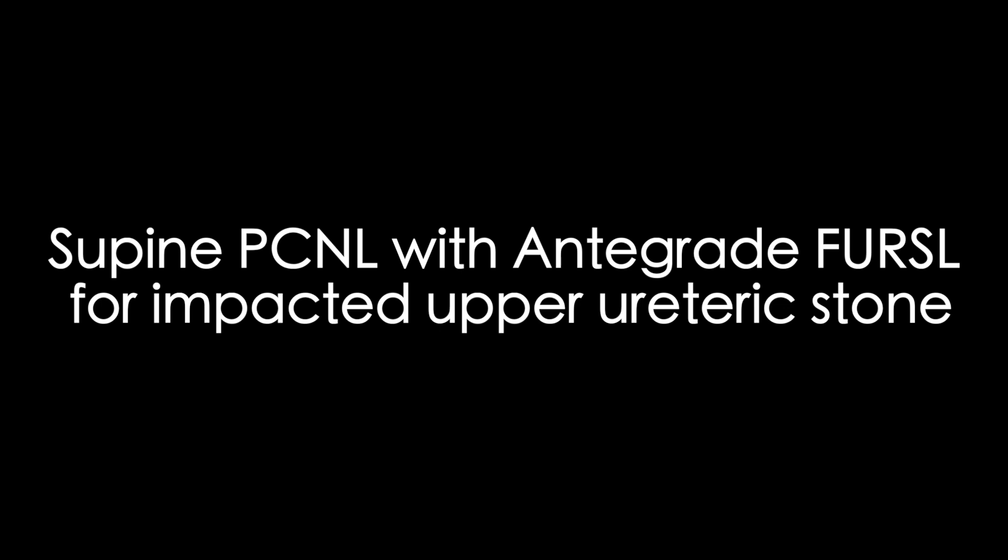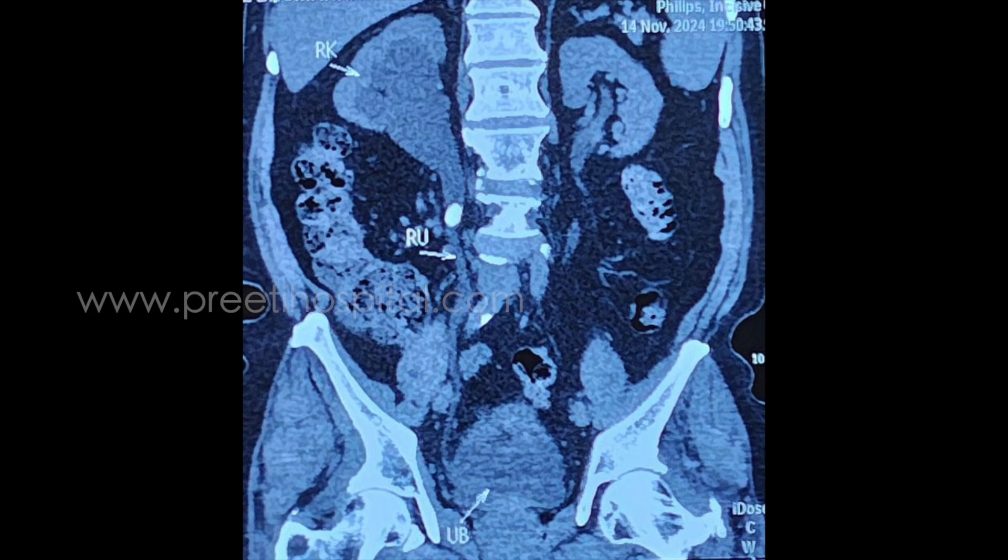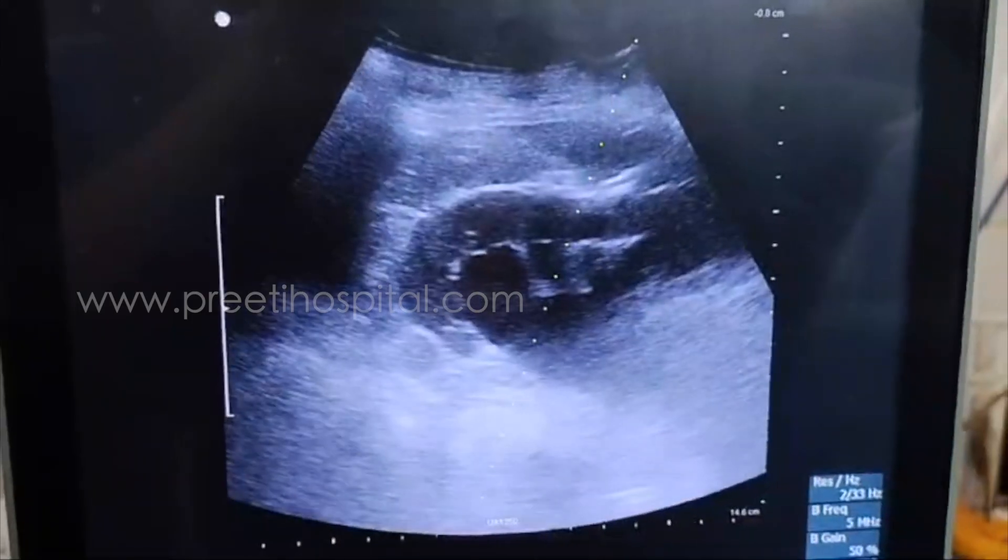This is a case of supine PCNL done for an impacted upper ureteric stone. Here we are showing certain difficulties faced with the management of this case. This is the impacted upper ureteric stone of about 15mm size.